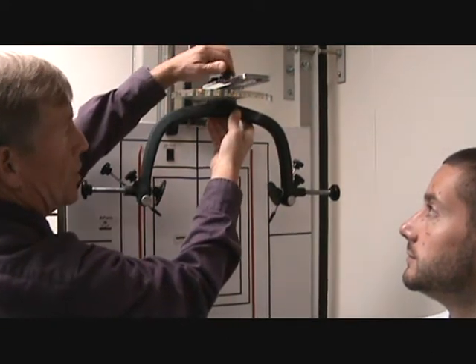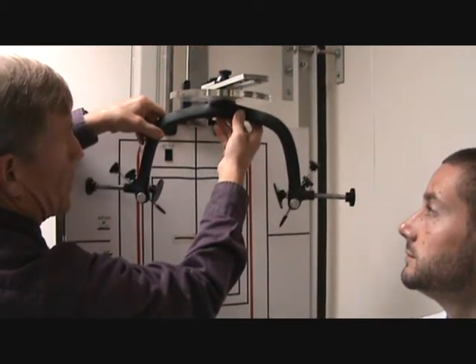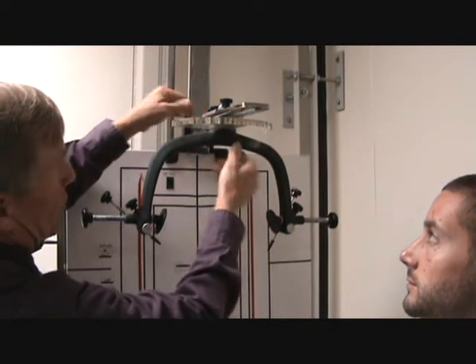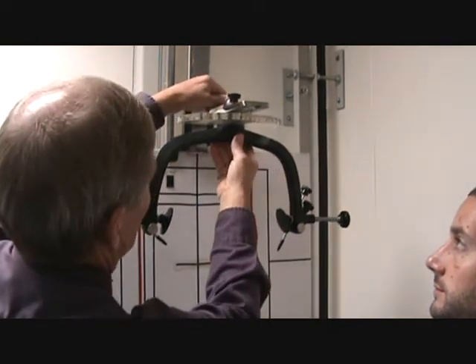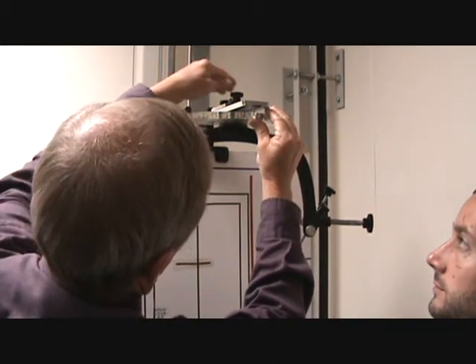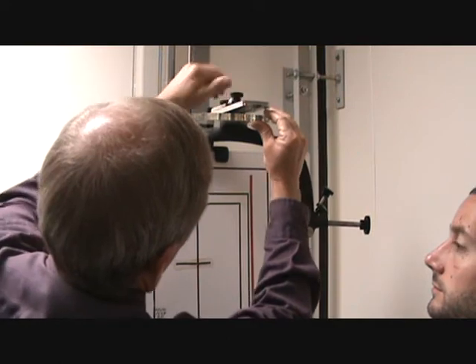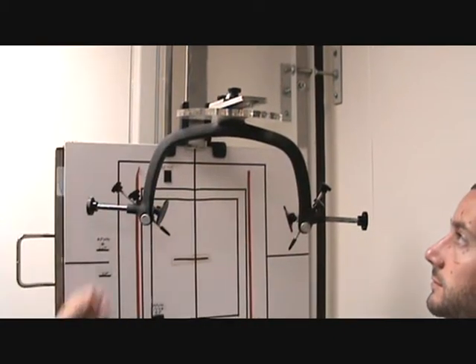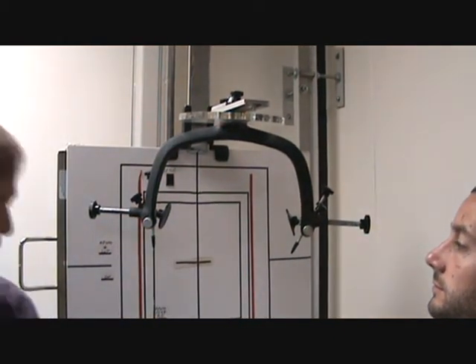We can also loosen this knob and turn this to whatever degree setting we want. For the right protracto view, the patient is turned 26 degrees because the condyle has converged 26 degrees. I'm going to pull this out and turn it to about 26 degrees. I need to have my patient sitting up straight and tall, marked so they have all the appropriate dots on the front of the face, and I also need to mark the transverse processes, because that will factor into this protractal view as well.